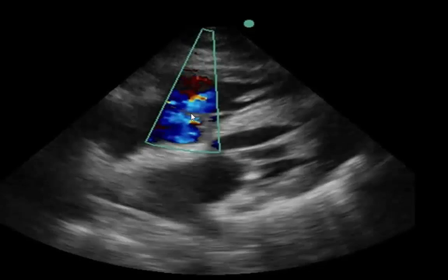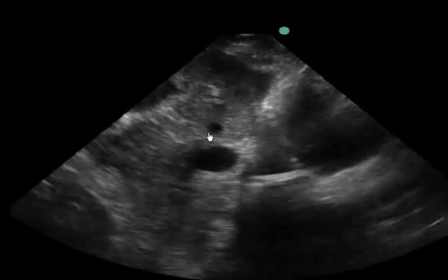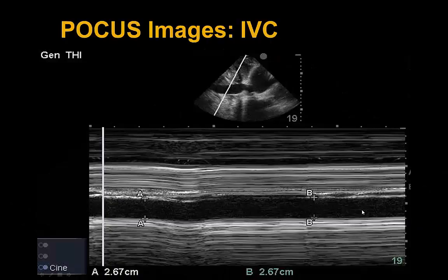Looking at the IVC, there is distension with small microbubbles indicating recirculation and high right atrial pressures. The IVC is distended at 2.6 centimeters with no respiratory variation, confirming elevated right-sided filling pressures.